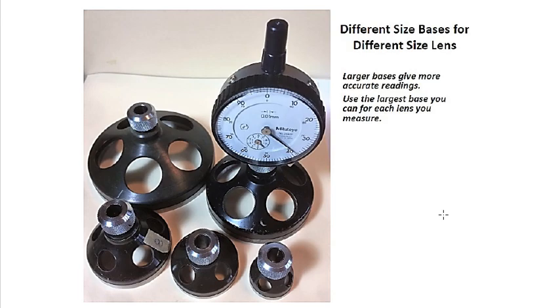We have different ring bases because you have different sizes of lens. Larger bases give you more accurate readings, and you're going to use the largest base you can for each lens you measure. So now you get an idea of how to set up a spherometer by using the dial gauge with the base.